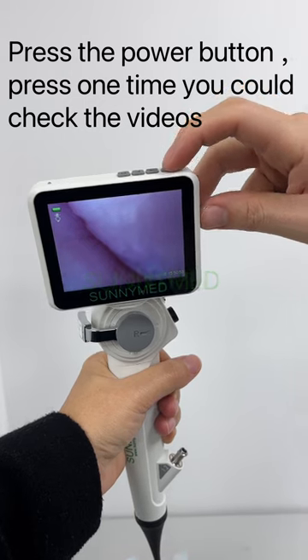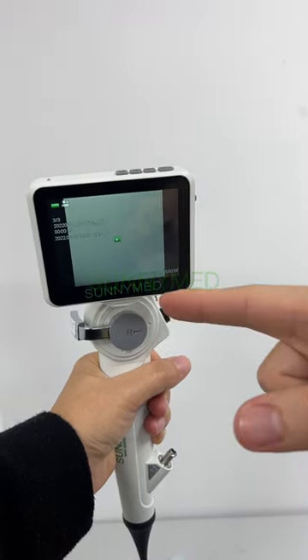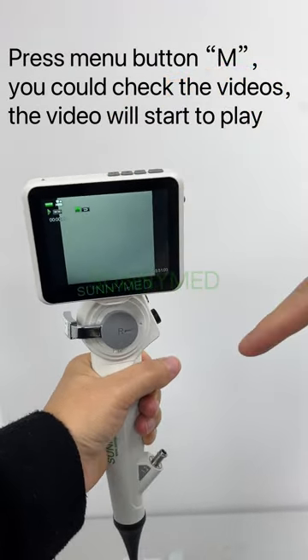Press the power button to check the videos. Press the menu button and the video will start to play.